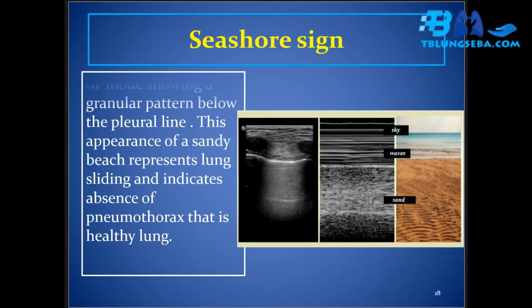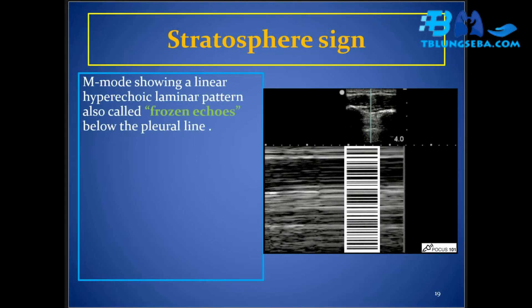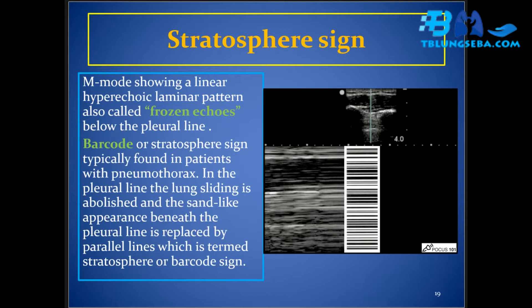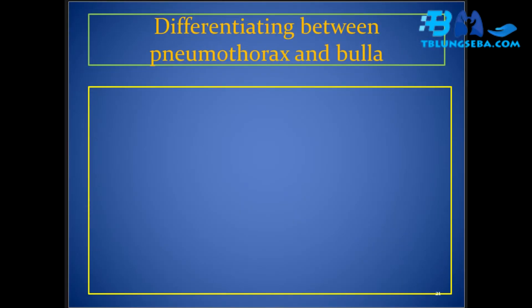The seashore sign on M-mode shows a granular pattern below the pleural line; this sandy beach appearance represents lung sliding and indicates absence of pneumothorax in a healthy lung. The stratosphere sign, also called the barcode sign or frozen echoes, shows a linear hyperechoic laminar pattern on M-mode typically found in patients with pneumothorax. In pneumothorax, lung sliding is abolished and the sand-like appearance beneath the pleural line is replaced by parallel lines, termed the stratosphere or barcode sign.